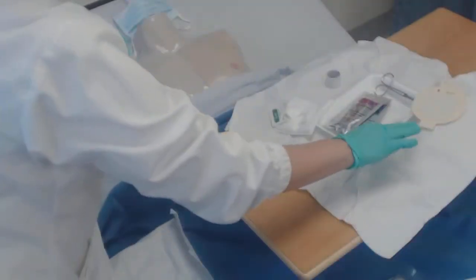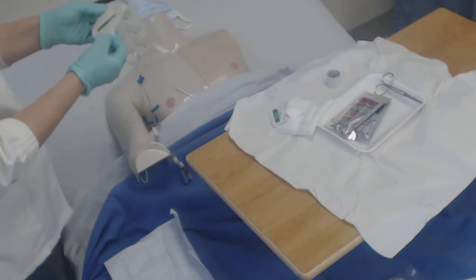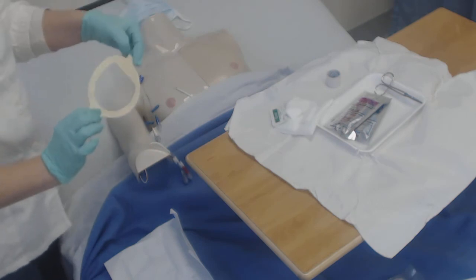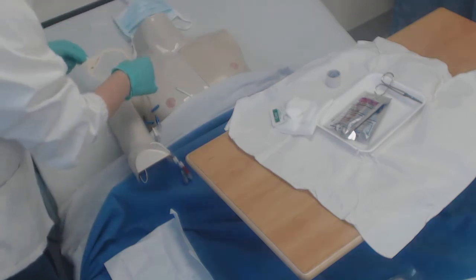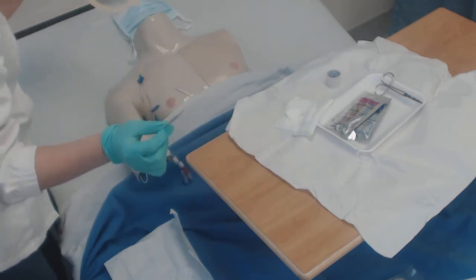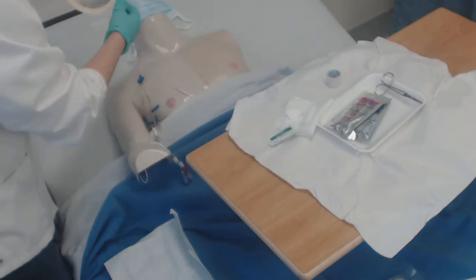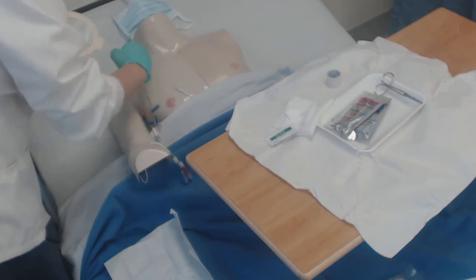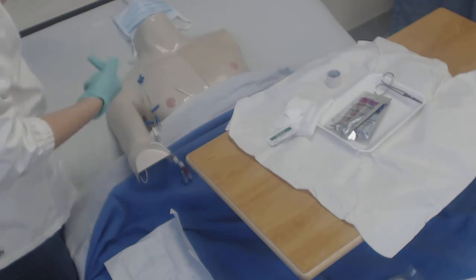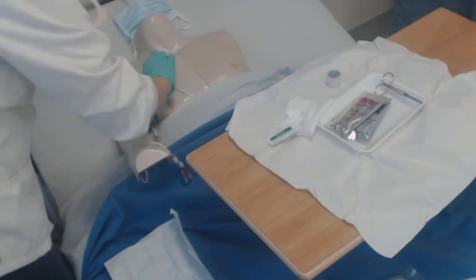Now I'm going to grab my Tegaderm. These are kind of specific to whatever hospital you're at — this one's oval, some of them are not. This would also be the point where, if your hospital requires antibiotic ointment on the insertion site, you go ahead and do that. You're going to be looking at the insertion site and document redness, drainage, pain, swelling — anything out of the ordinary that could signal an infection.